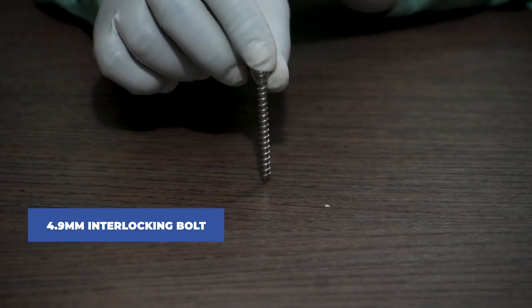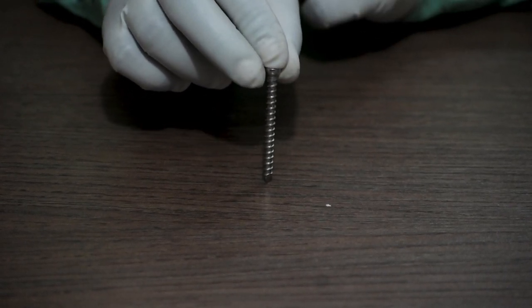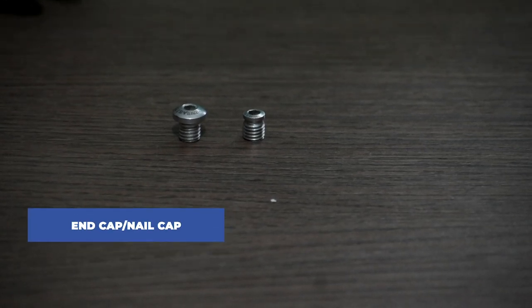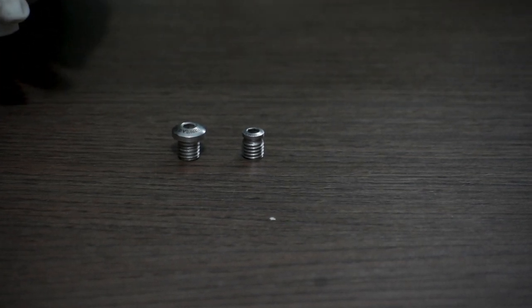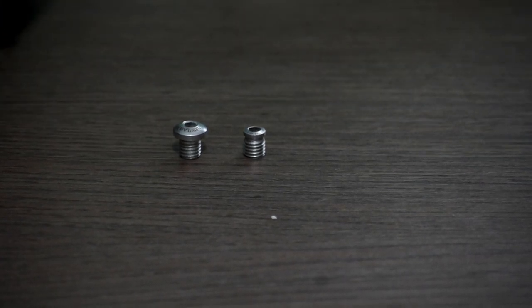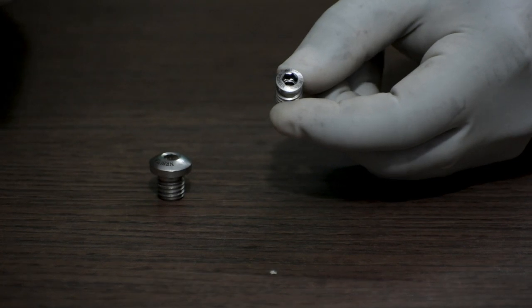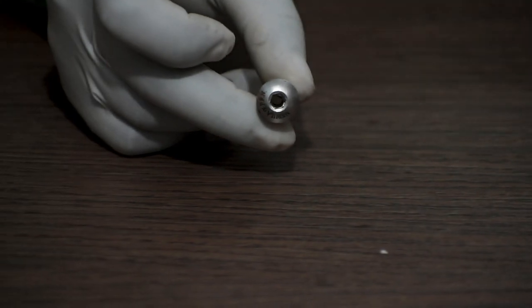Next is the 4.9 mm interlocking bolt, provided in lengths ranging from 28 mm to 50 mm. Next is the end cap, fixed on the head of the nail, available in sizes of 0 mm, 5 mm, and 10 mm. This one is a 0 mm and this one is a 5 mm end cap.